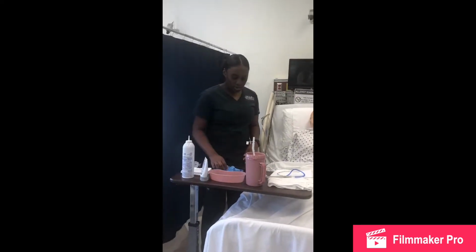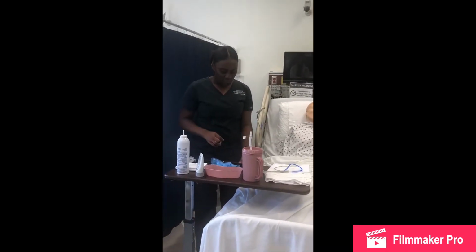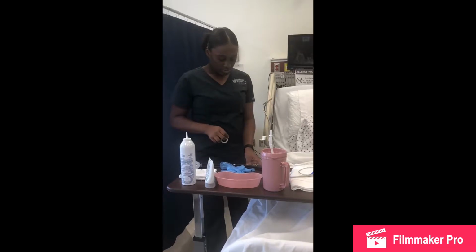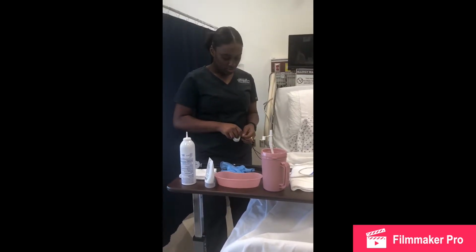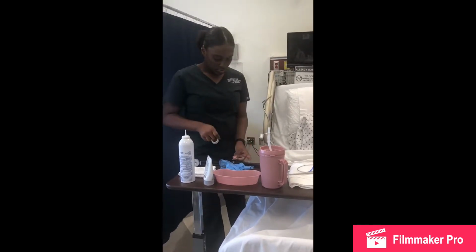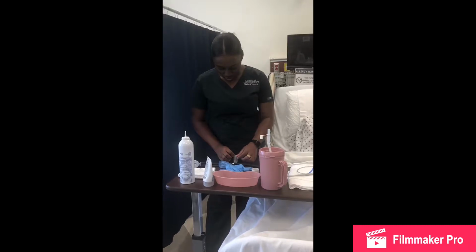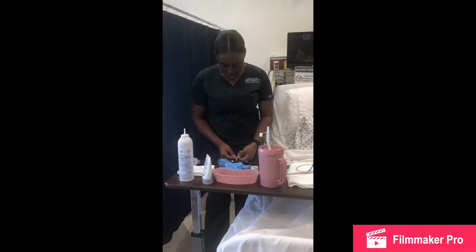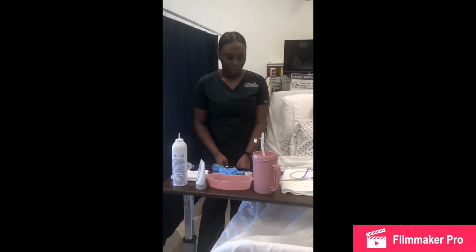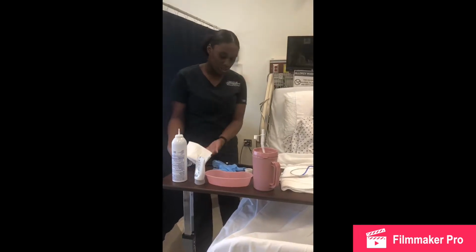I would start setting up all the things I would need. So first I would do my tape. I will need 4 pieces of tape. The last piece of the tape, I would then split in half. That will be placed on the patient's upper nose. I already have my lubricant on my washcloth right here, so I will set this right here.